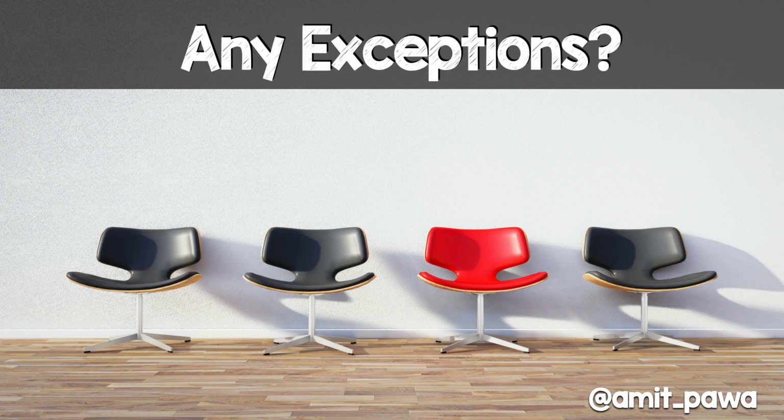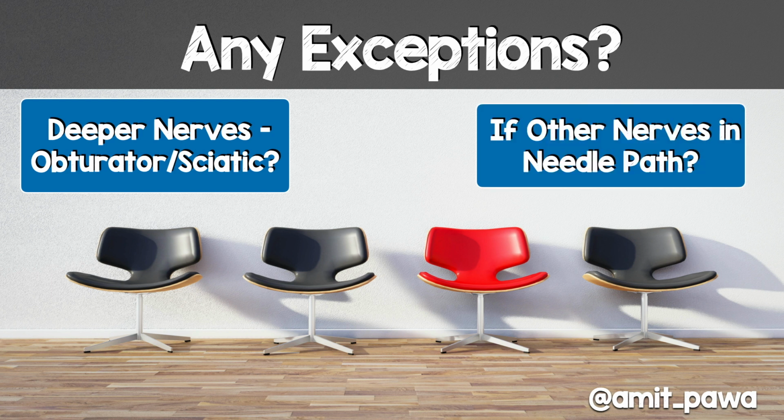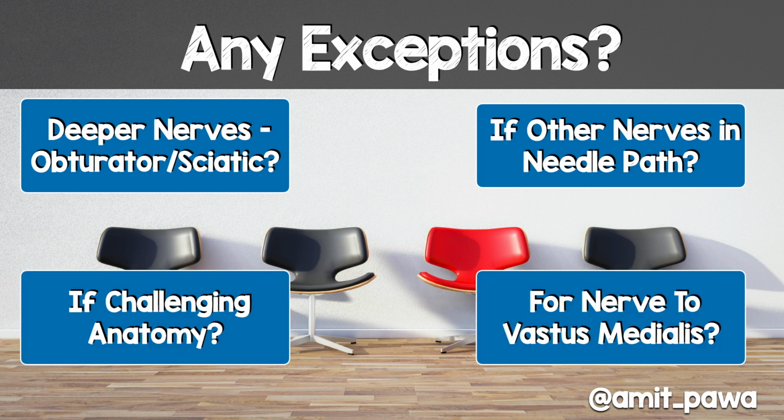So are there any exceptions? Well, clearly we've heard Dr. Gadsden talk about some of these. Maybe there are, if the nerves are deep or difficult to visualize, and I have had the occasional block where it's been difficult to do with ultrasound alone. Maybe if there are other nerves in the needle path, if there's challenging anatomy, and as we've heard already, maybe we can use it to identify the nerve to vastus medialis. But the question is, do we need nerve stimulation for every single block? And I would argue no.